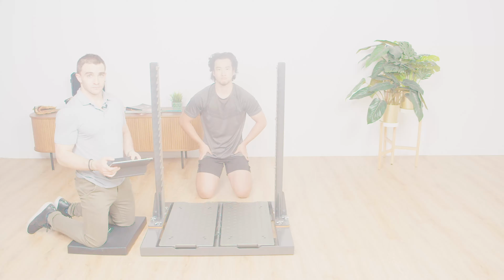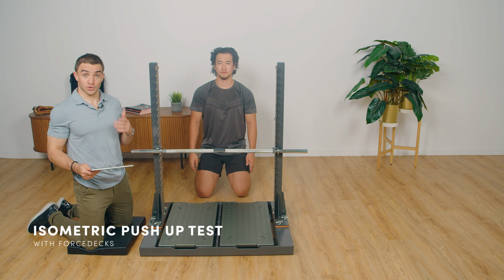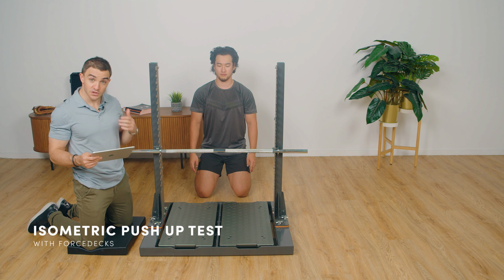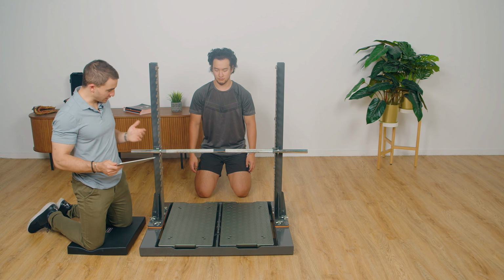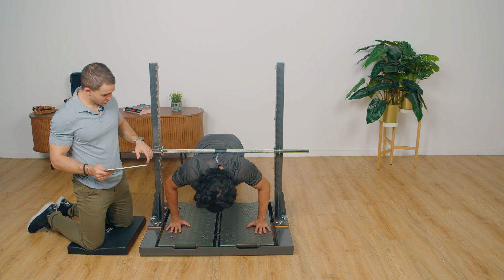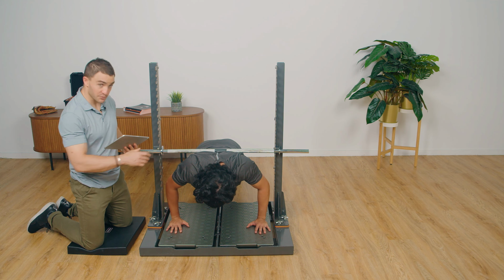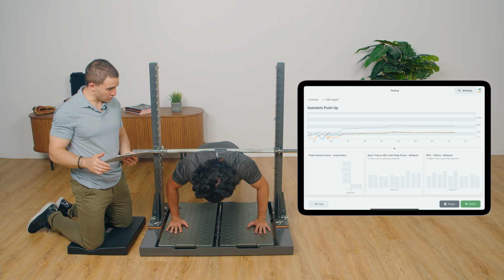Now, in addition to assessing the push-up, we can also look at maximal strength doing an isometric push-up using the force decks. So what I'll have Cal do is do a push-up into this bar. So Cal, when you're ready, go ahead and hop into position. Feet out into push-up, good. Just be careful there. Now gently take up a little bit of pre-tension. Hard to hold this position, so we'll go quick. When I say go, Cal, I want you to push hard and as fast as you can.